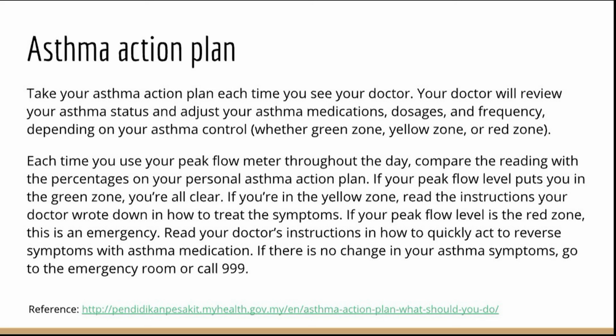So in conclusion, why do we need to measure peak expiratory flow rate? It is to monitor the progression of asthma control, as well as to enable the patient to take early intervention in case the patient is in an emergency condition.